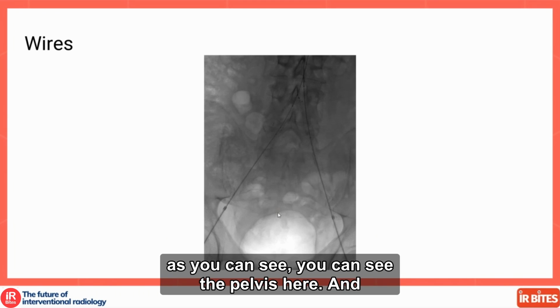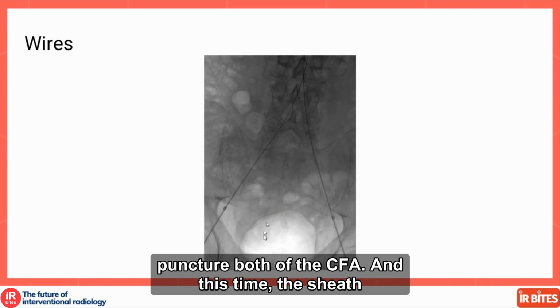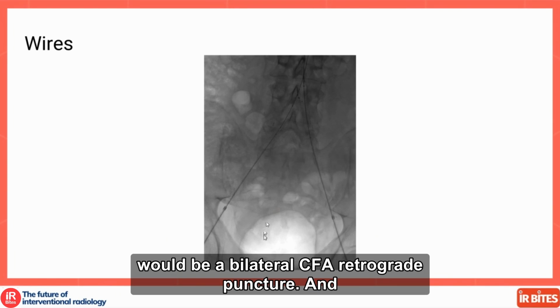So as you can see the pelvis here, and instead of one sheath, there's two sheaths. So they puncture both of the CFA. And this time, the sheath is in the opposite direction of the blood flow. So this would be a bilateral CFA retrograde puncture.